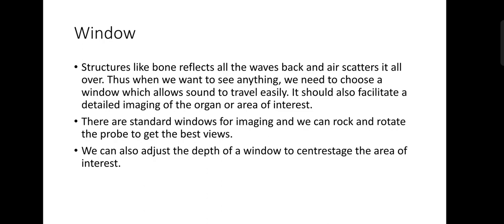We need to choose a window which allows sound to travel easily, and it should also facilitate a detailed imaging of the organ of interest. There are standard windows for imaging, and we can rock and rotate the probe to get the best views. Echocardiography windows are best defined, and we can also adjust the depth of a window to center stage the area of interest.